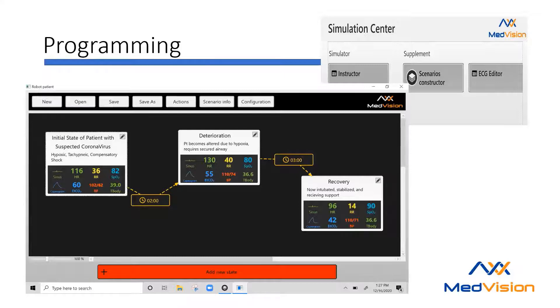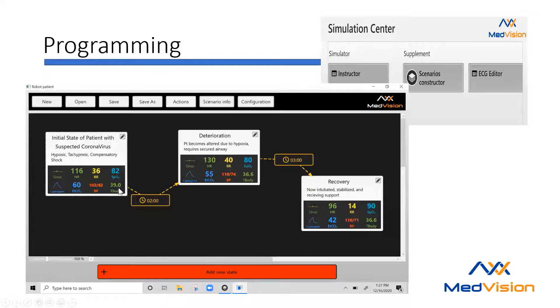This is their user interface. You can go to scenario constructor. I went to new — it starts off with initial state. So I created those symptoms which would be relatively seen in a patient suspected of coronavirus. His heart rate's accelerated, his respiratory rate is tachypneic, he is severely hypoxic, his end tidal is high, his blood pressure is low, and at 39 Celsius he has a fever of just a little above 102. So he's definitely suspicious. If you saw this patient, as I wrote the scenario, he just presents — whether you're EMS, nursing, or wherever you are, you might see this kind of patient.